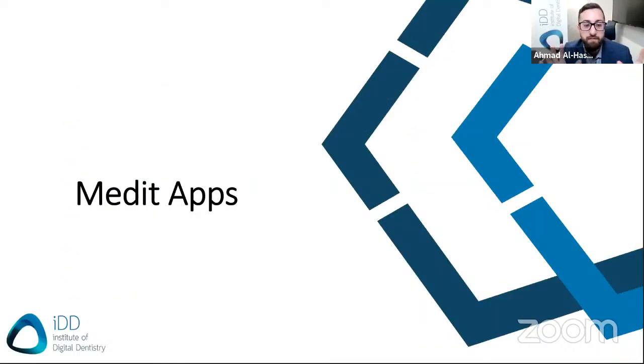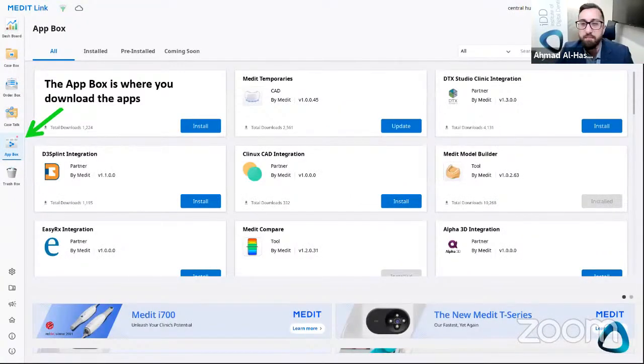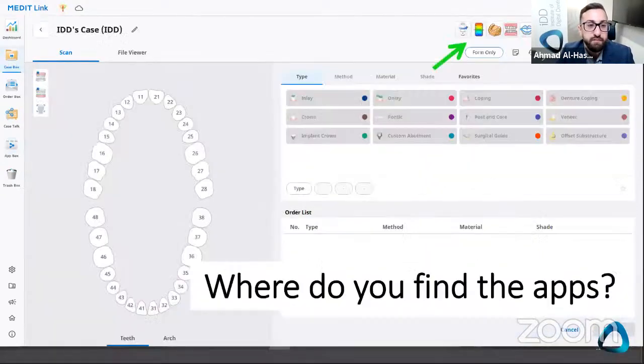So we're running out of time, but for the last part, I'll go over the Medit apps. Basically, in the Medit software, you find the apps in the app box, on the bottom left, and that's like their app store. To use the apps, you actually have to open a case, and you'll find the apps where that green arrow is, up there near the case. When the case is open, you find these little boxes once you've downloaded the app.